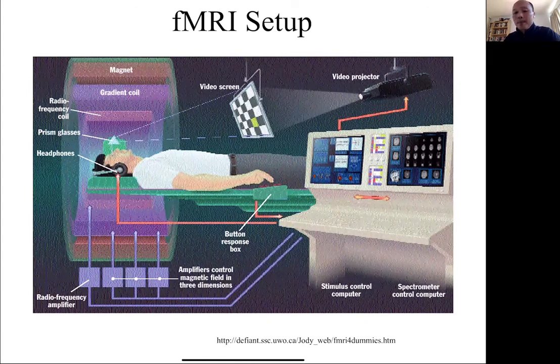So the setup is very similar to an MRI exam, in which case you typically just put the person in the scanner. The only difference with the fMRI exam is that in a lot of the experiments, you're actually having the person actively doing something, maybe playing a video game, maybe gambling, maybe watching scary pictures, maybe looking at different political ads. You're basically having them do something, and then you're watching what their brain does as they're doing it.